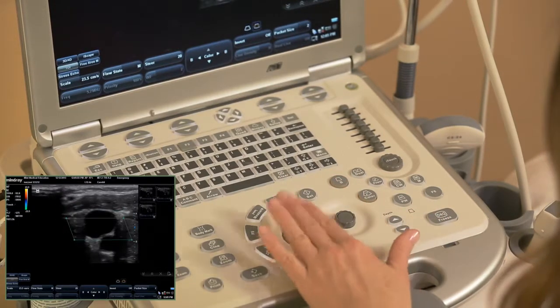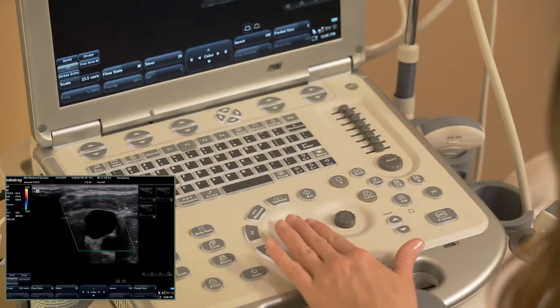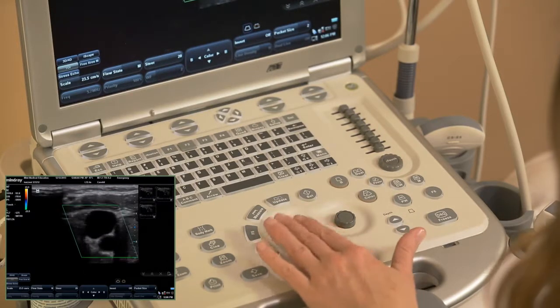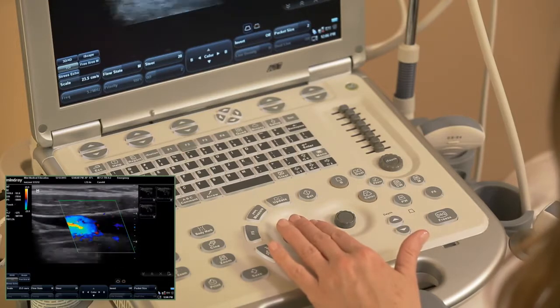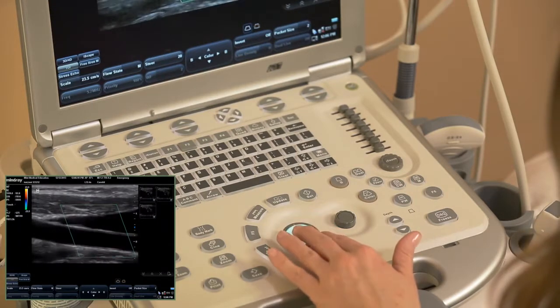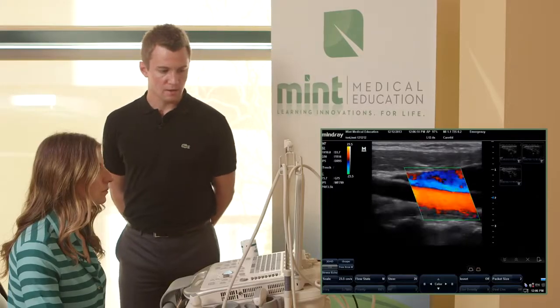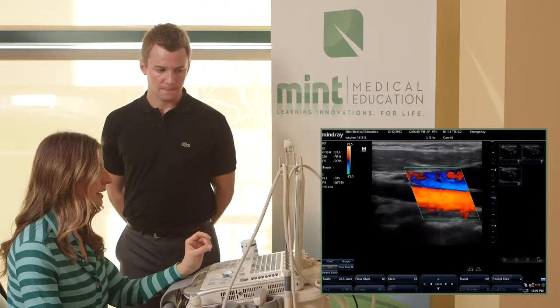Very good. You jumped on that set button. Well, it's kind of intuitive, yeah, it is. But that makes sense. Yep, right. So you've been using the trackball and the set key for so many other things. It's just kind of one of those next logical steps that you might hit that set key. And what that did is it allowed you to change the box size, and then when you hit set again, it allowed you to move the box up and down. And so you've adjusted your depth, and now we see that little too much gain there, color gain.